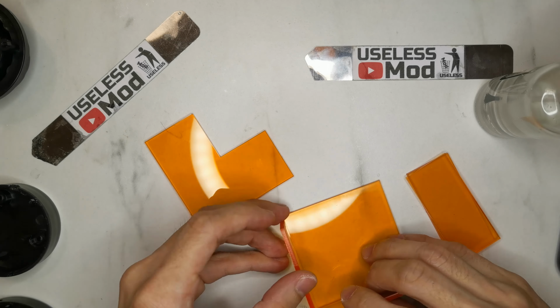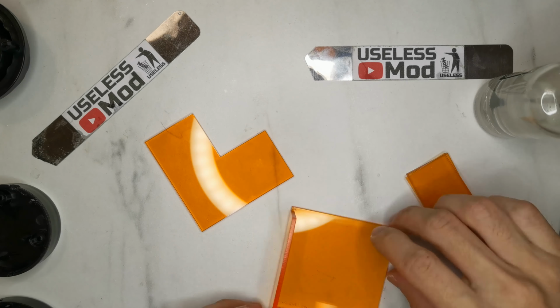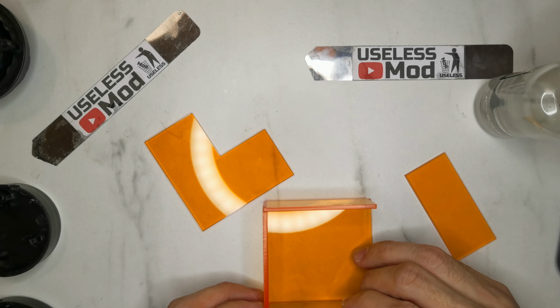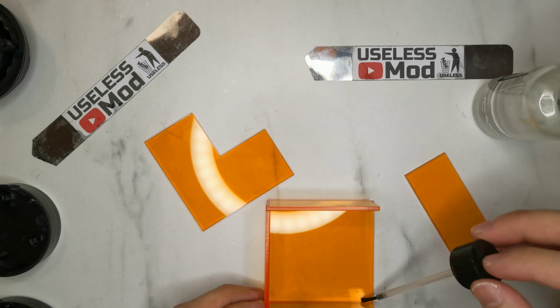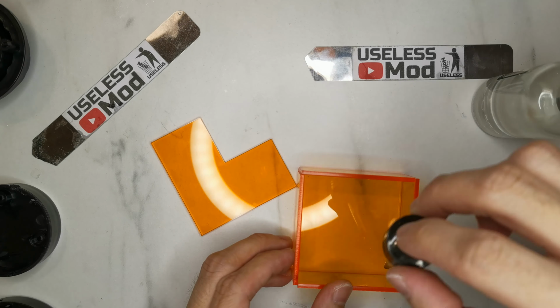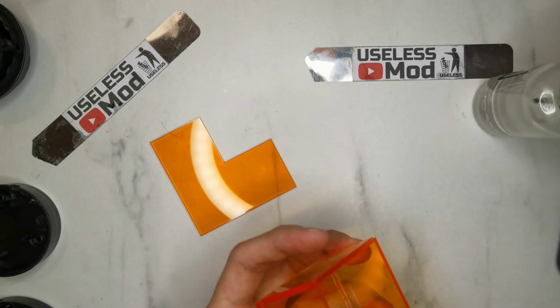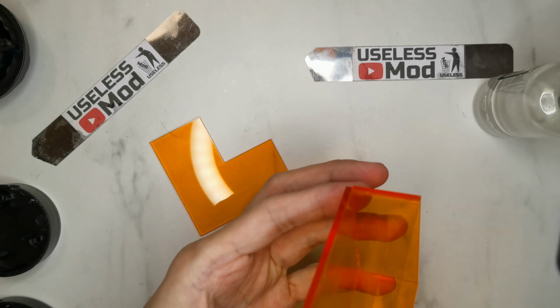We can start to make the mold. The first step is to make the box. I will skip the detail of mold making and casting in this video. If you want to know more, you can refer to my past video, and I will make a series of tutorials on how to make mold, casting, and everything.